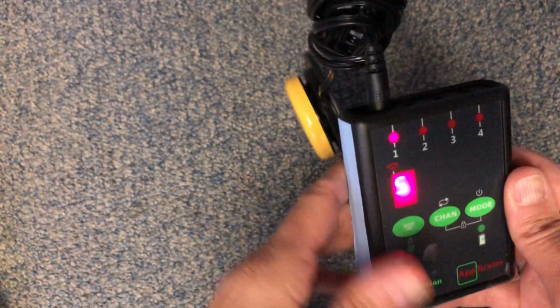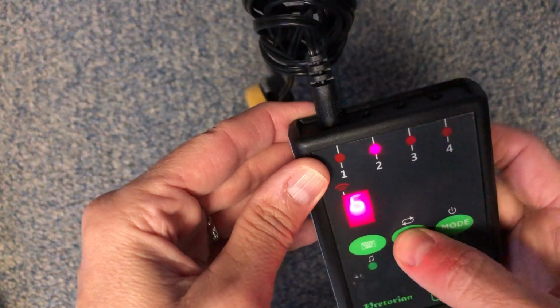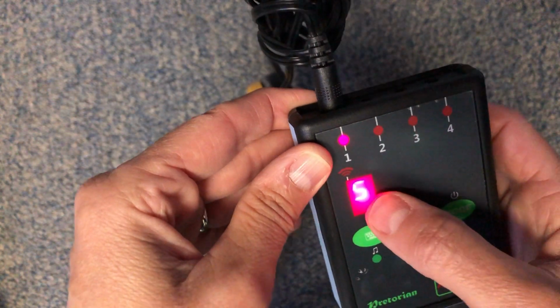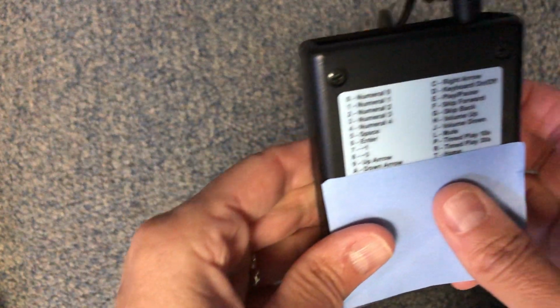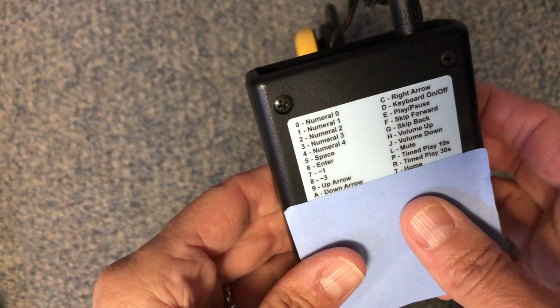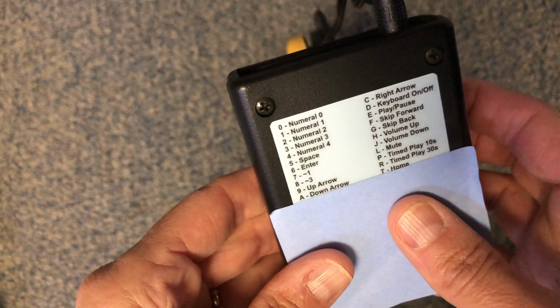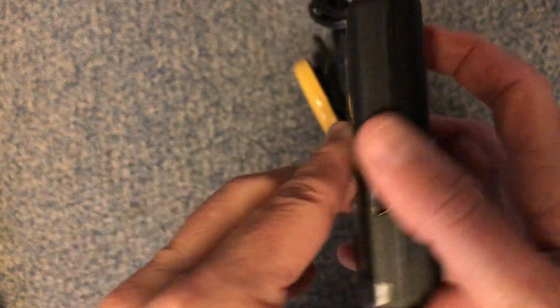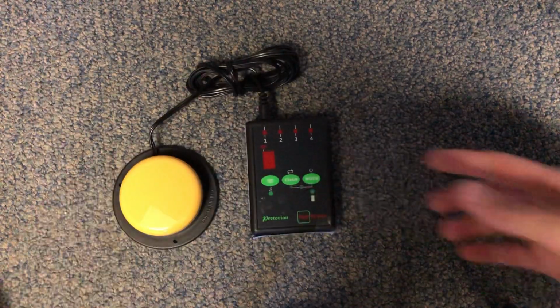All right, now what you can see here are these numbers, and these are called channels. I can move the channel, and it's just where I want my switch or switches plugged into. So here's channel 1, it's on number 5, which means spacebar, and I learned recently that spacebar is a good thing, that it helps progress things on an iPad, so I'm going to leave it right there. I've got my jellybean switch plugged in to channel number 1.